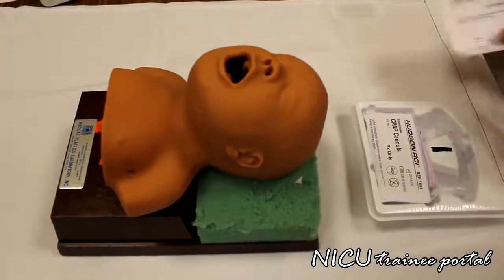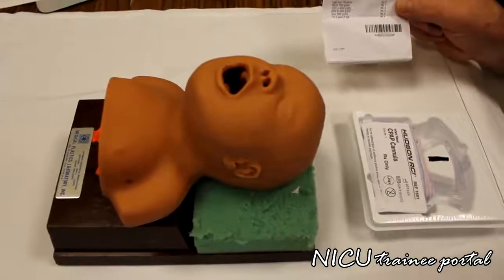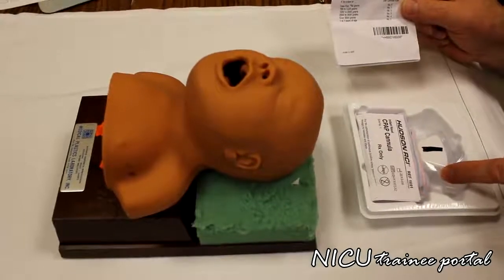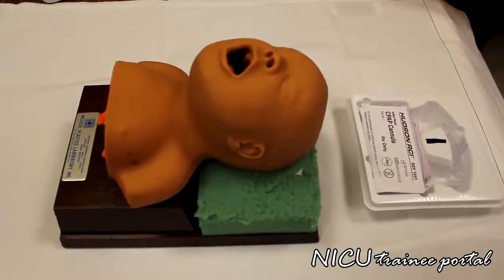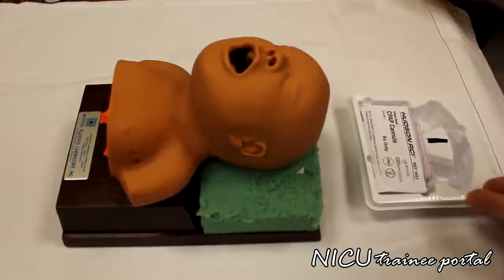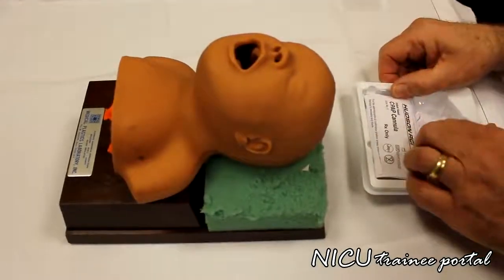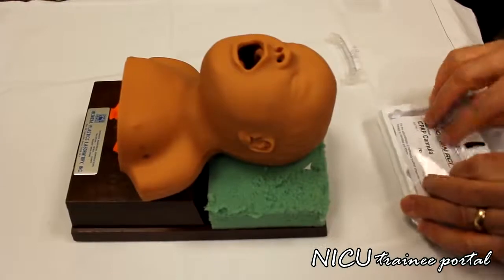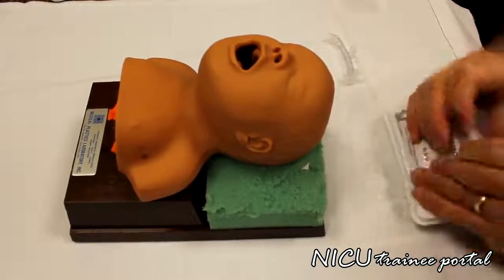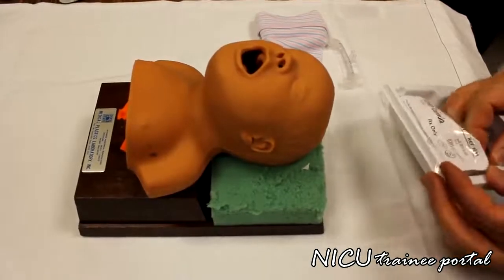So we match up the size of the baby with the size of the prongs, and this is the graph that comes in the prong setup. So we've determined this baby is going to be a size 1. So we just open it up and we take the parts out, and take the hat and the other pieces.